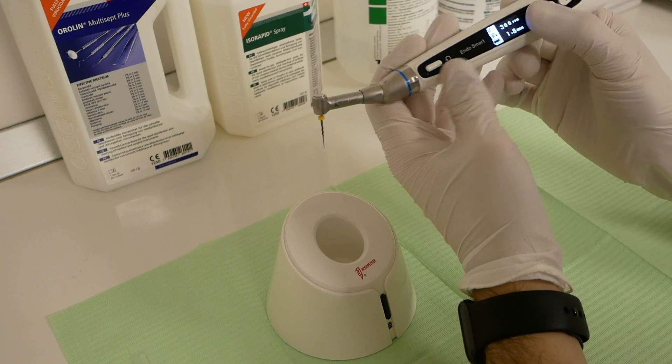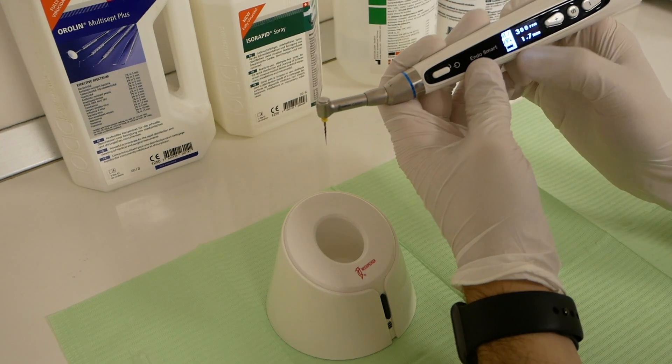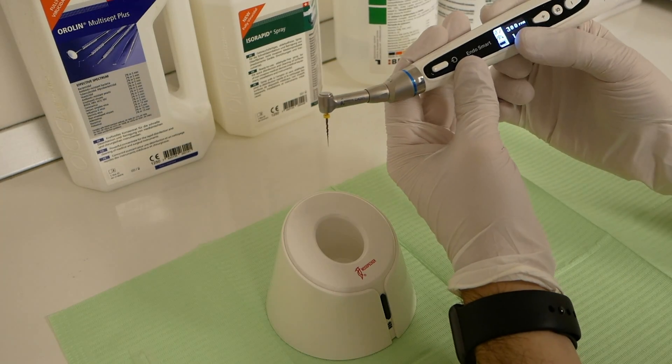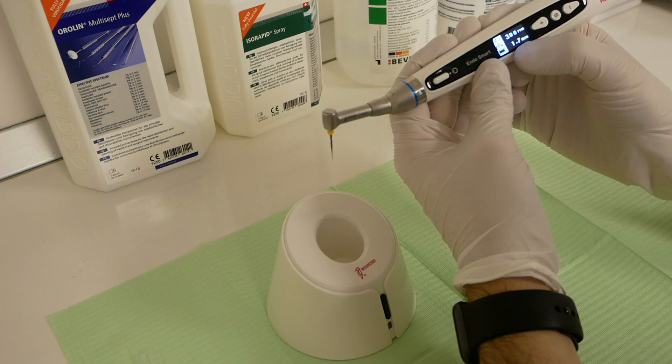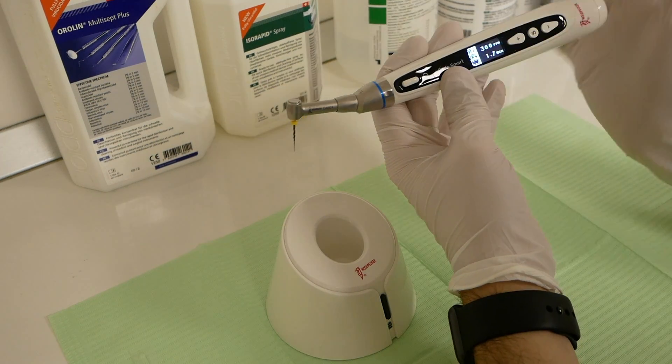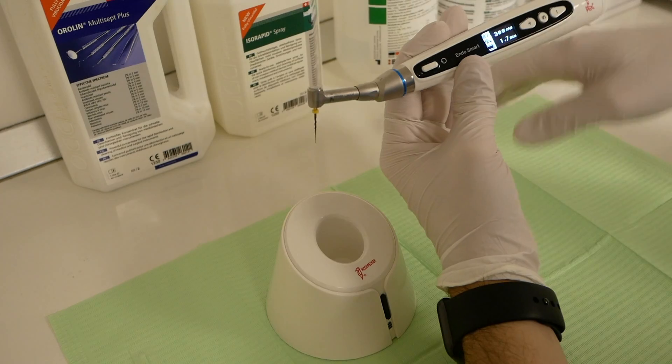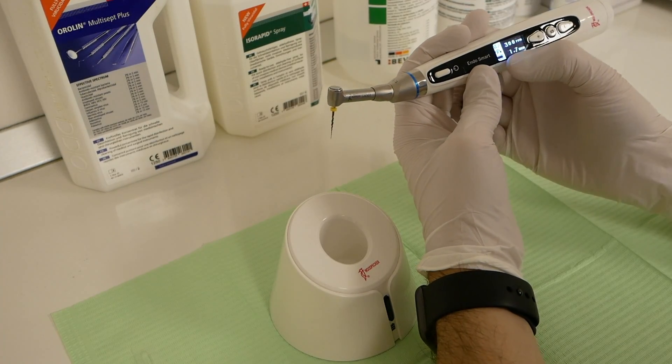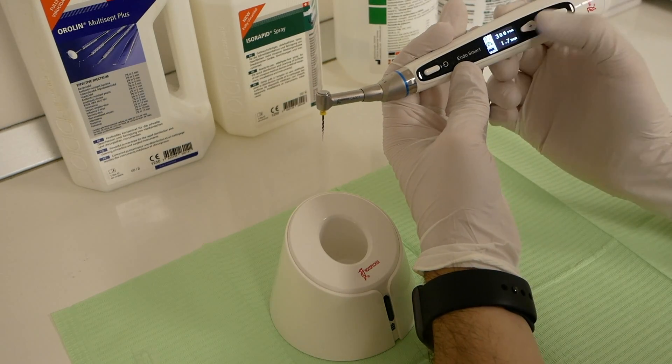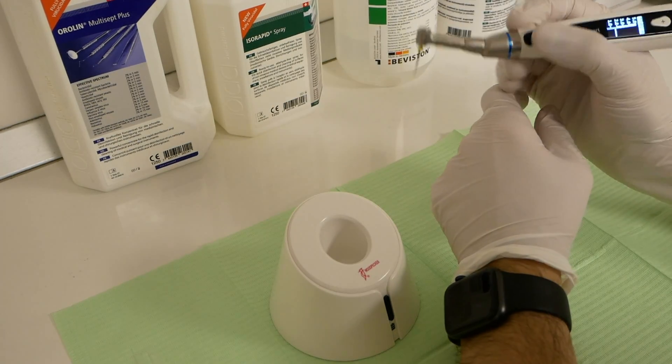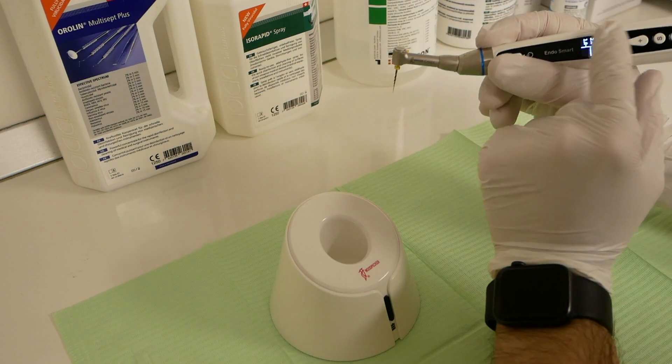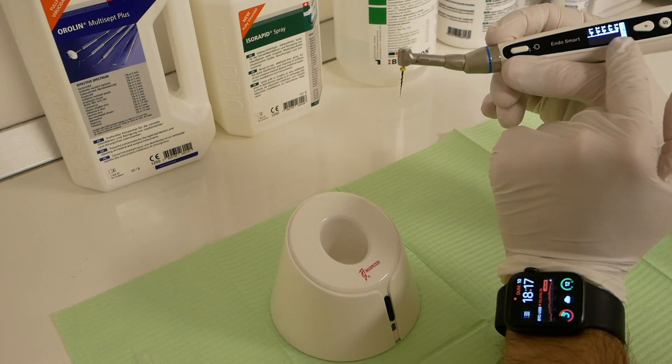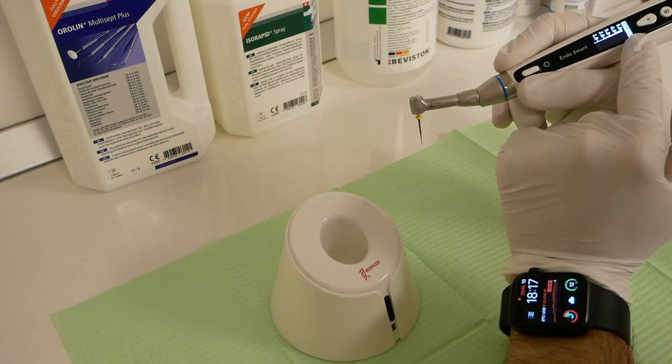And then you'll just select the program with the rotations per minute you require for the file you selected, and the torque, and also the movement. It supports normal rotation or reciprocation. You just activate it. When the file is working, you will see the live values of your torque.